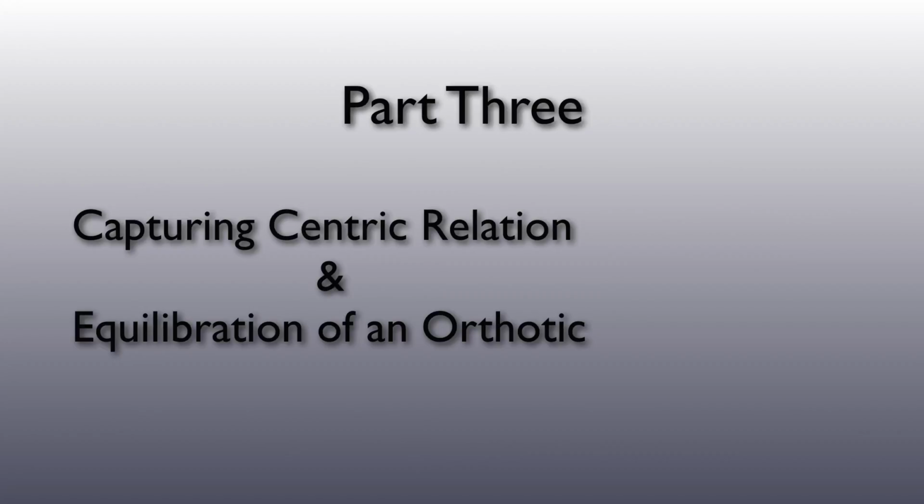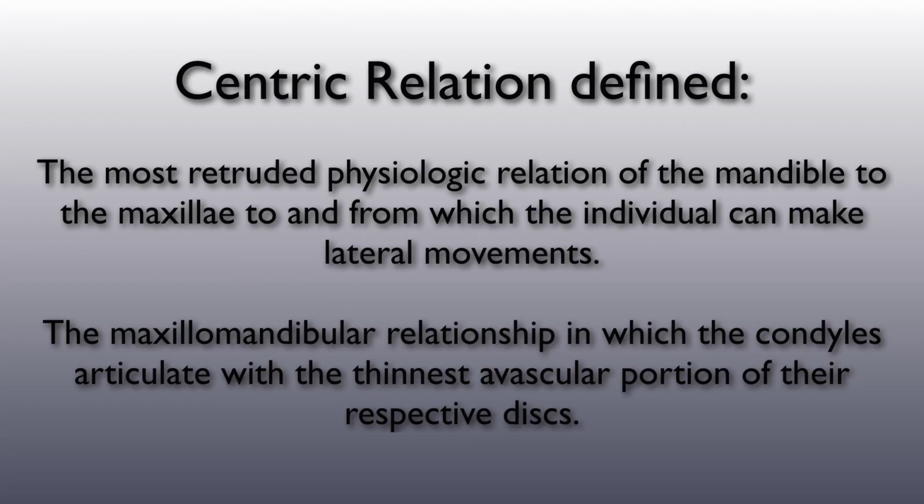In this Part 3 video, we will discuss techniques for capturing centric relation, and then equilibration techniques using all the previous information to adjust an orthotic. In the glossary of prosthodontic terms, there are unfortunately several definitions of centric relation. But if one boils it down to the essence of the concept, it is really two things.